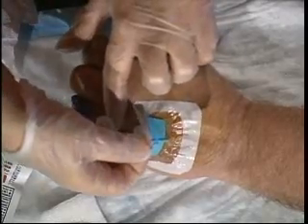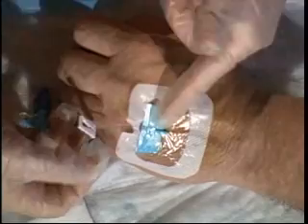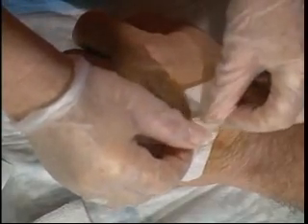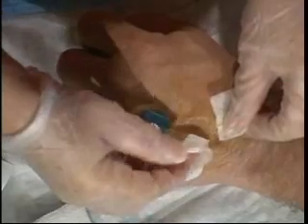I lift the catheter extension, which loosens the tape at the base of the extension where it's wedged onto the catheter wings. And then I'm going to stabilize the wings so it doesn't pull against the skin. Now, there are times where you have patients who may have very fragile skin, or they may have had so much tape adherence that their skin is really sensitive and you don't want to tear the skin. Sometimes what you can do is use an alcohol-based swab and just gently rubbing it against the adhesive-backed material will loosen and actually dissolve some of the adhesive, so it will lift off the skin without tearing the skin.